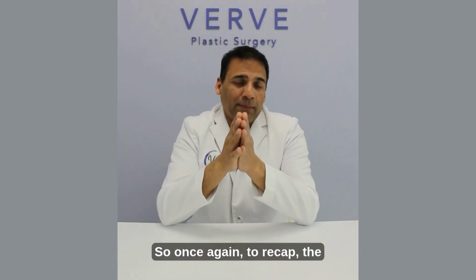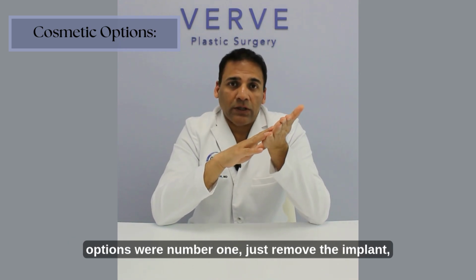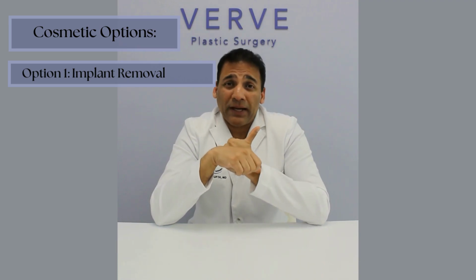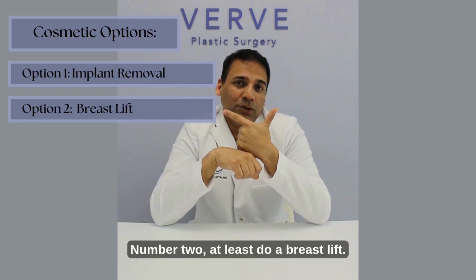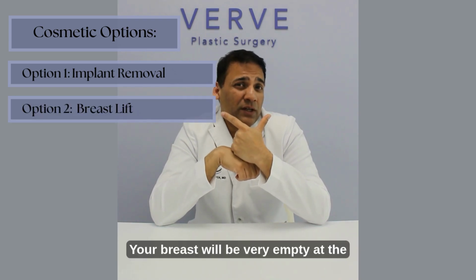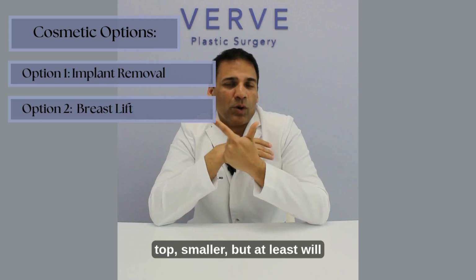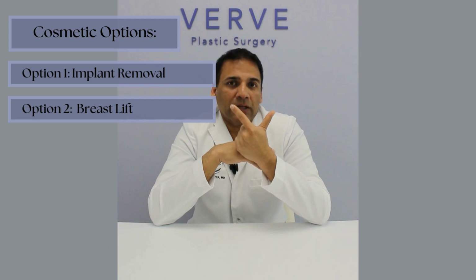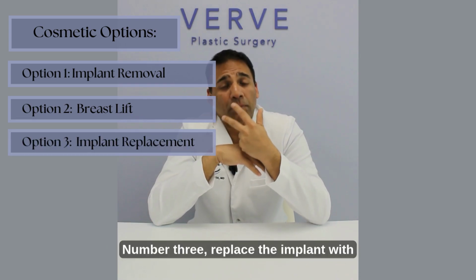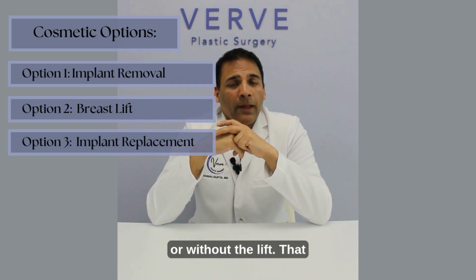So once again, to recap, for cosmetic patients, you will have the options. And the options were, number one, just remove the implant, do nothing, not very aesthetically pleasing. Number two, at least do a breast lift. Your breast will be very empty at the top, smaller, but at least will not have too much sagging and extra skin. Number three, replace the implant with or without the lift.